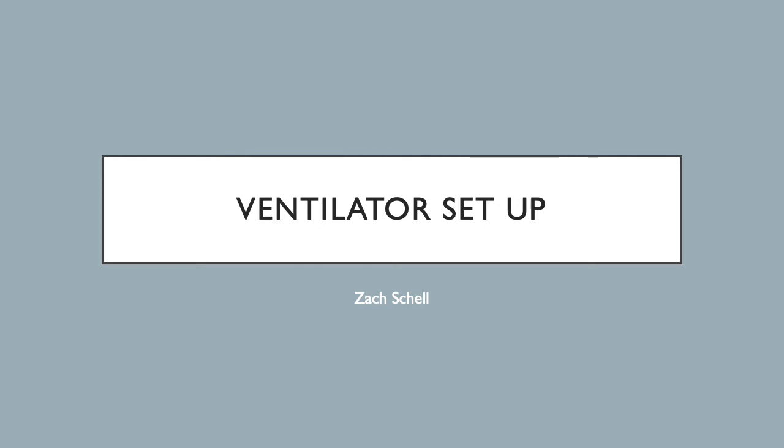Hello everyone, my name is Zach Shell and I will be giving you a quick rundown on how to set up the ventilator and perform the required daily ventilator check on the Avant CS2 ventilator.